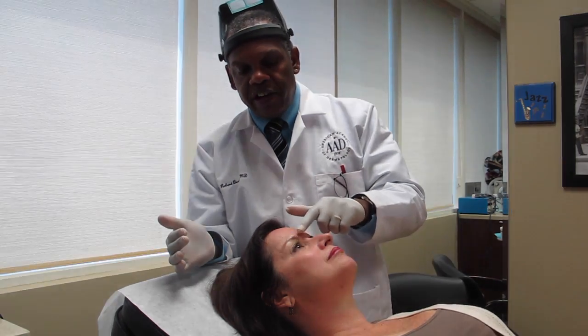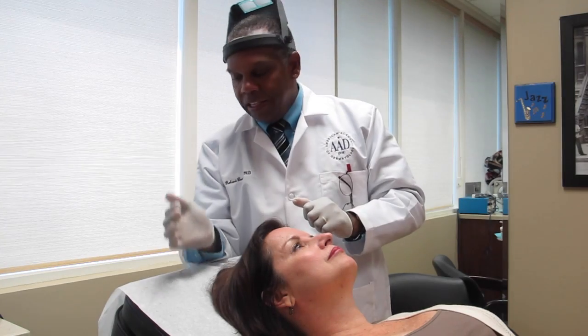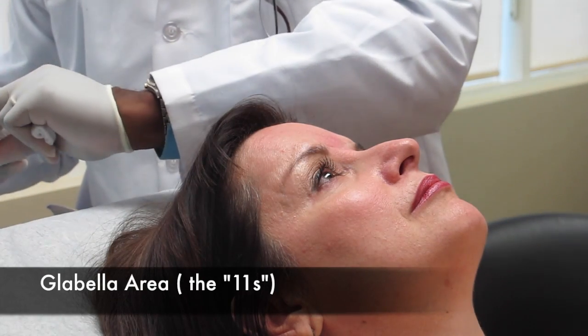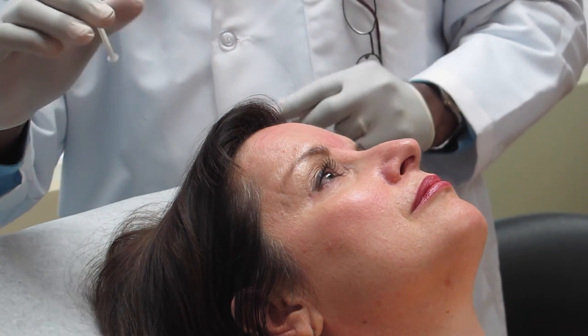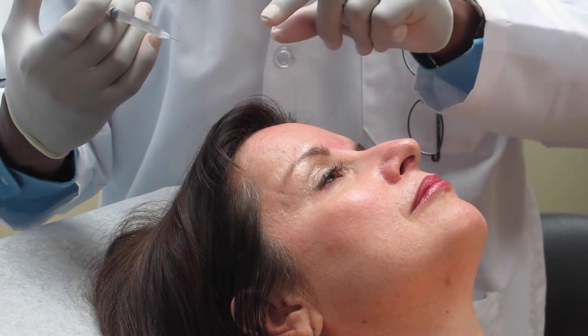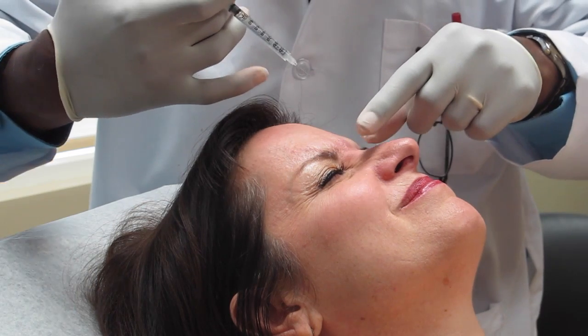So it's going to be three injections here and two right here in these muscles. It's a very fine needle — just a 30-gauge needle, which is about the size of a hair — so usually discomfort is not much of a problem. Okay, here we go. Could you frown real hard for me? Good — now relax it.